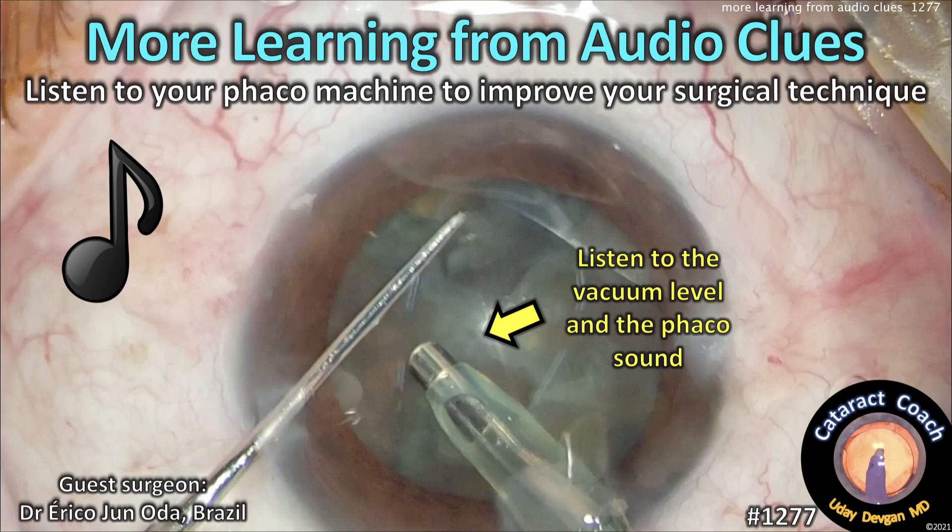CataractCoach.com, more learning from audio clues. Listen to your phaco machine to improve your surgical technique.